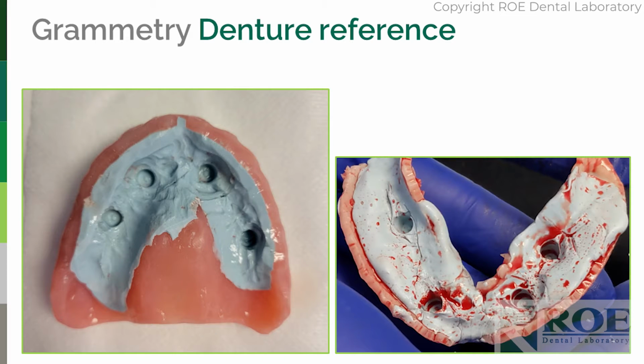A patient can either have an existing denture or you make an immediate. We can design them, you can print them. We can design them and print them and ship them to you any way you like. No problem. We can also make you beautiful finished dentures that the patient can wear if you're not going to deliver that same day or maybe even the next day. So there's options there. Okay, patient comes in, you have a denture that you're going to use as the reference. That is your reference for the scan, the healing collars, the bite, the teeth, the tooth position, the vertical, everything.